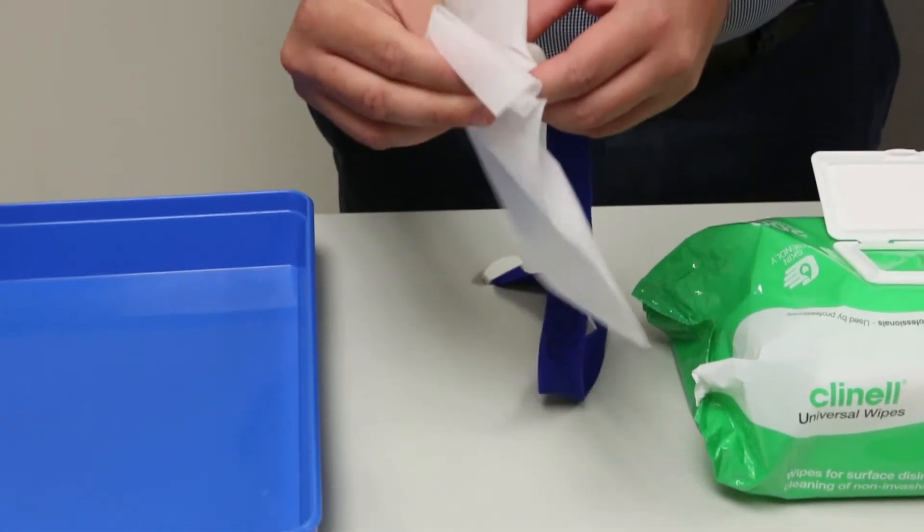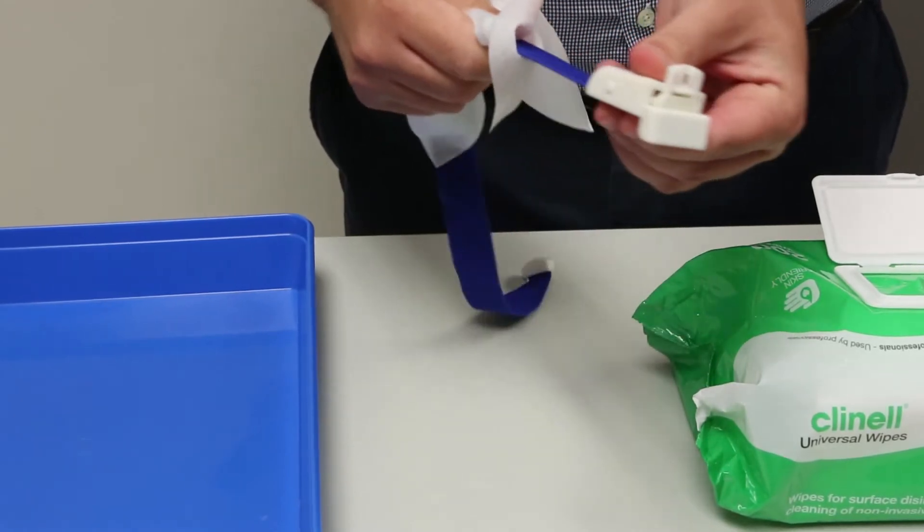Step 3. If a tourniquet is being used, clean with a disinfectant wipe.